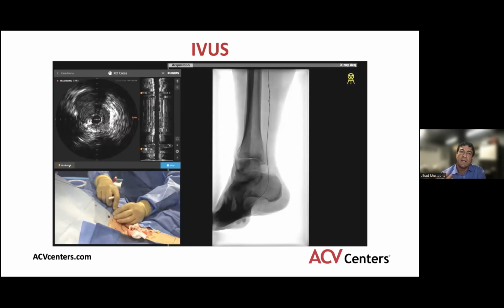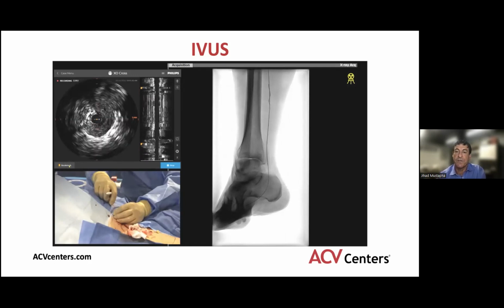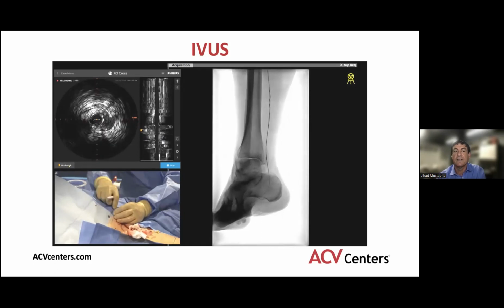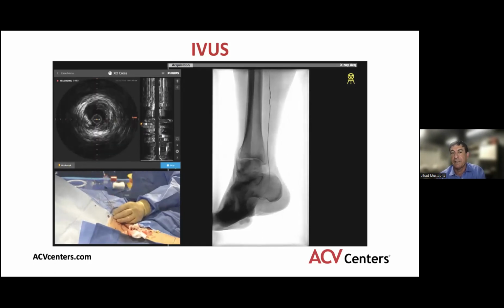Number two, is there any significant concentric disease that also involved here? Or is there an embolization that has happened when you look at this? Was there an embolization that happened that obstructed the posterior tibial artery and the plantar artery? That is important to differentiate between all of them. Because of that, probably using laser would be a good idea because of the thrombus, organized thrombus, and also because of the possible embolized thrombi distally.